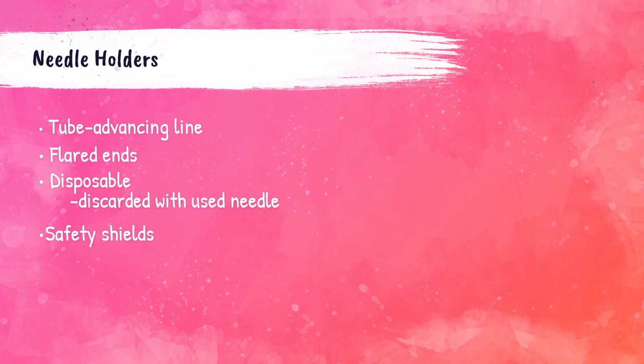The holder should remain attached to the needle and be discarded in a sharps container after the safety device is activated. The safety device must also always be activated as soon as you remove the needle from the arm against a hard surface, then disposed of immediately into a sharps container. You will activate the safety device while maintaining pressure on the collection site or while instructing the patient to hold pressure at that site. This safety device should not be activated with fingers or a soft surface such as a patient bed. It needs to be activated against a hard surface.